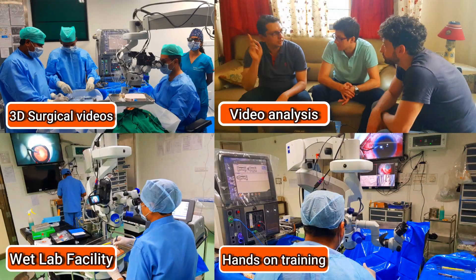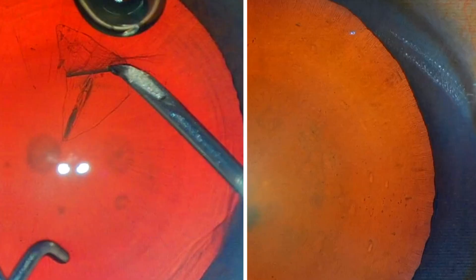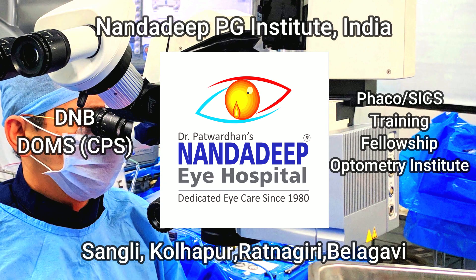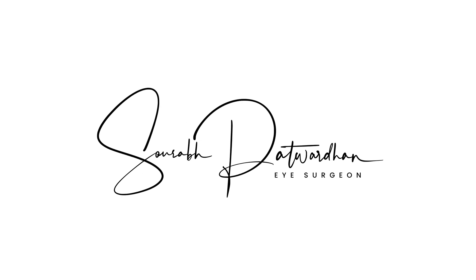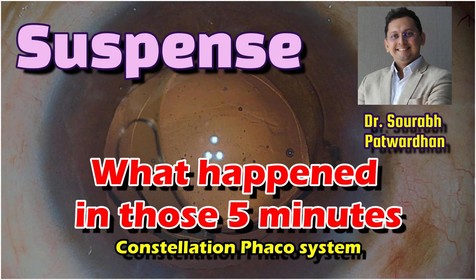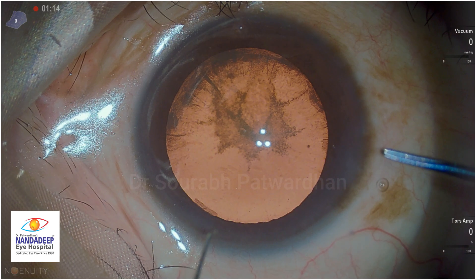In our center, we have a lot of teaching activities, which includes hands-on training as well. In this video, I am going to do a surgery on the Constellation Phaco system and there is some suspense. I want you to guess what happened in those missing 5 minutes of the video.